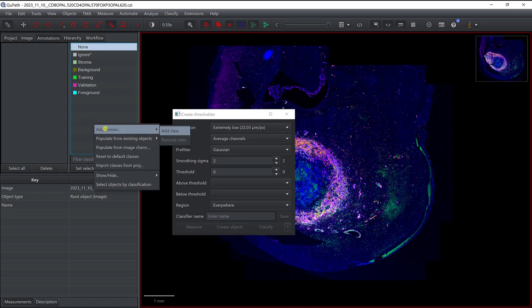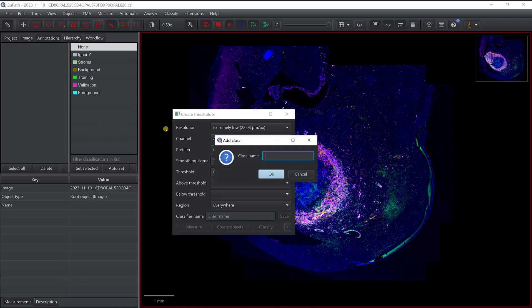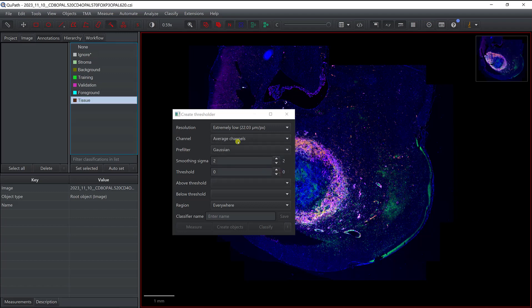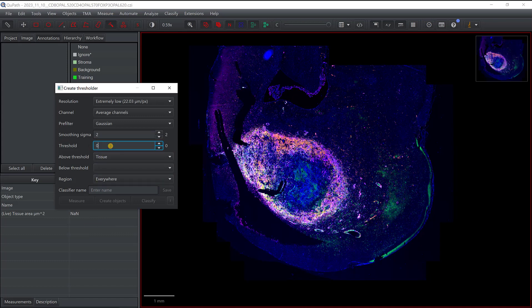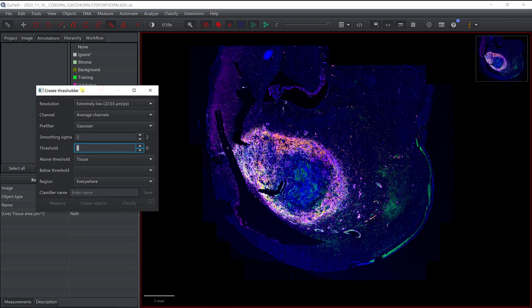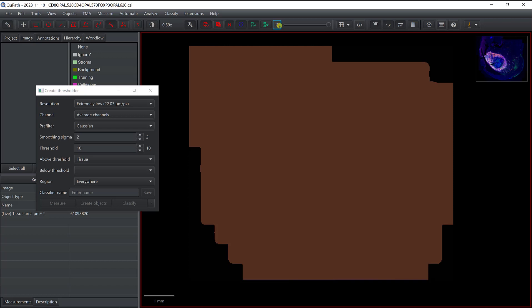I'm going to first define a new class for tissue. Everything that's going to be above the threshold is going to be part of the tissue. I can change the value and see what it gives, and using this toggle icon I can switch the view with or without the threshold overlay. Clearly the threshold is not high enough here.